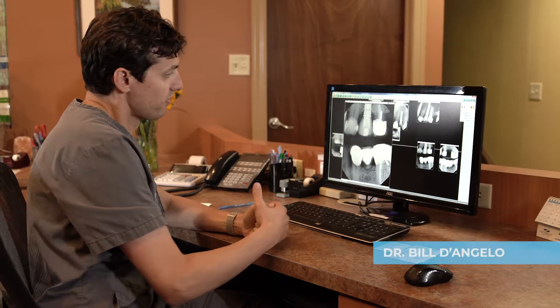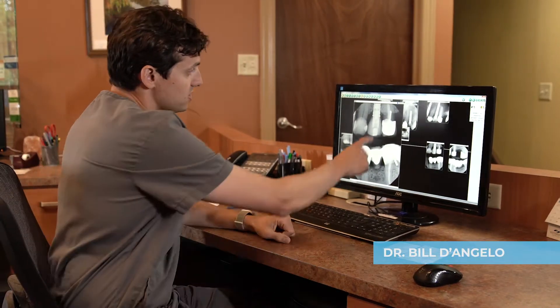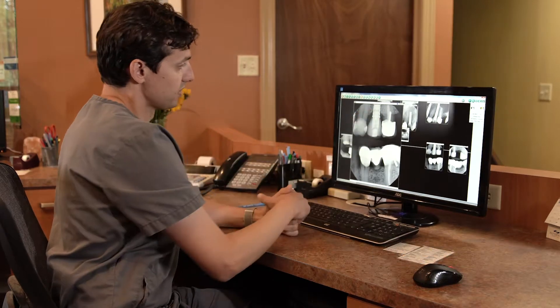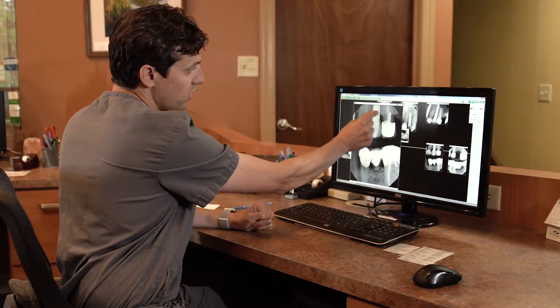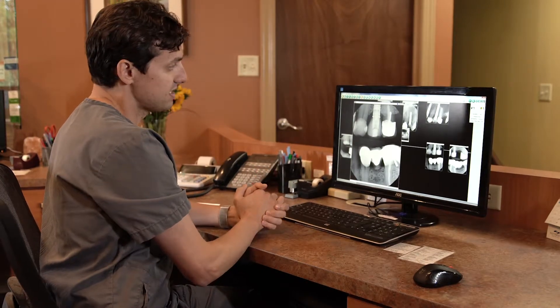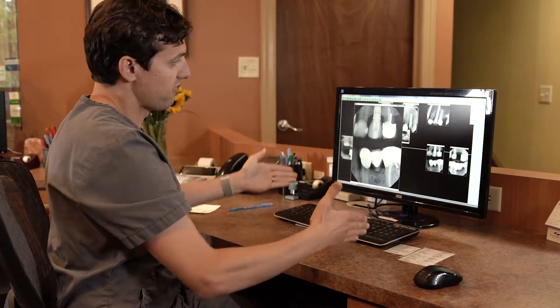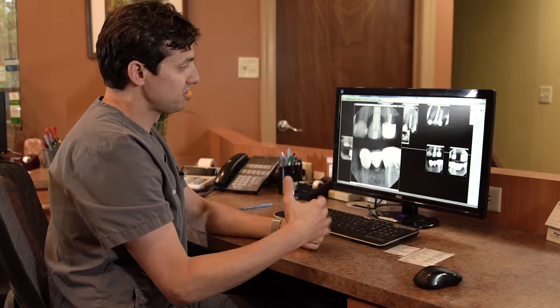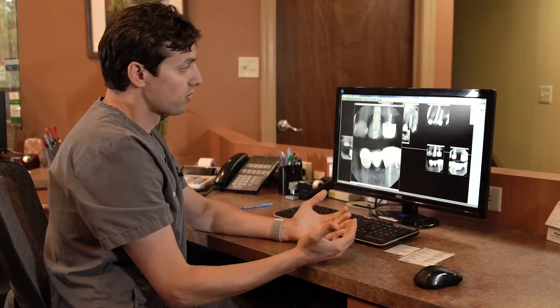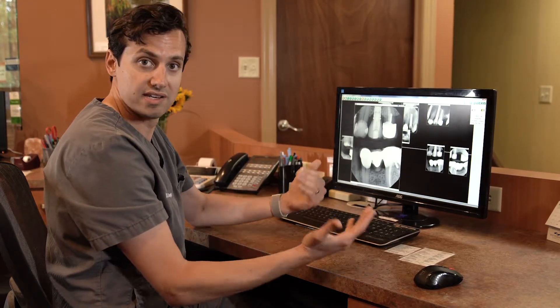I just wanted to show an example of a proper dental implant with a proper tooth on it. This is a traditional root form dental implant — you can see that it's very similar to the width of the tooth that used to be there. It's not a skinny mini dental implant. The implant comes out to the tooth in a very smooth fashion that allows it to look very lifelike and normal, and to be very cleansable. It's very important to have these different types of implants and teeth on them be very cleansable, so you don't get food caught around them and cause cavities on neighboring teeth.